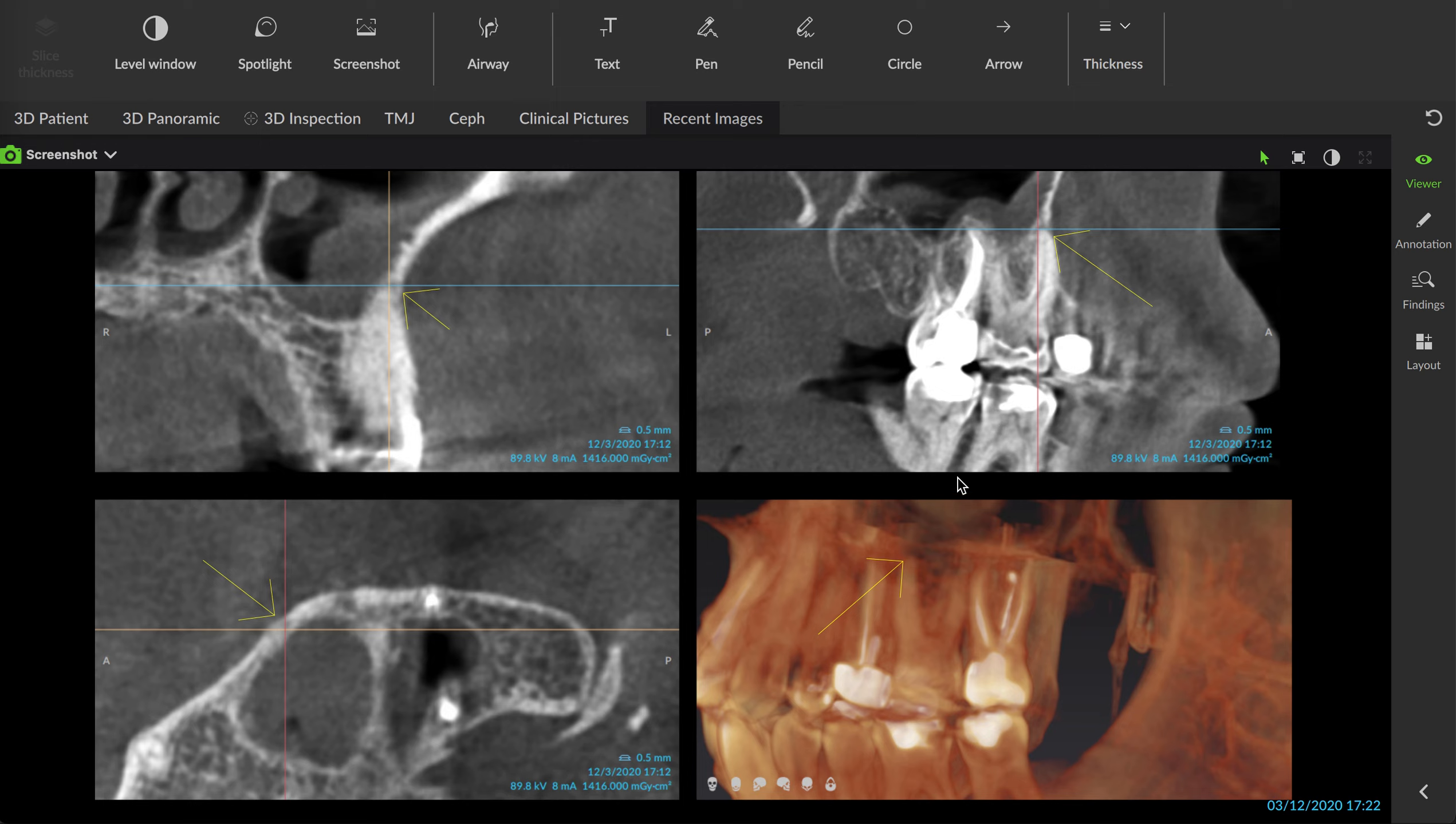CBCT highlights and clarifies and demonstrates exactly what's going on in this case. You can see the widening of the PDL space there on that mesial buccal root. Same thing here, that same area.